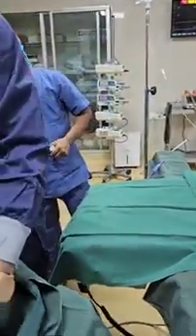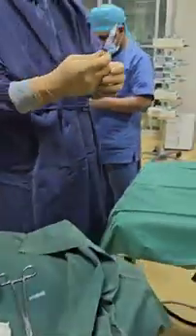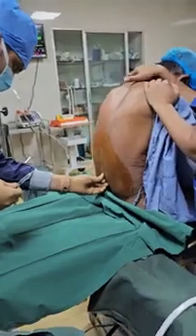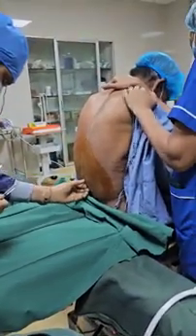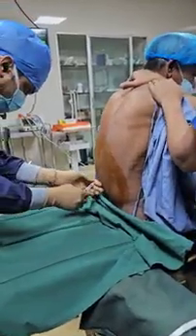Okay. We are going to take the baby needle. This is actually a 25 gauge needle. We are finding the space of the spine.